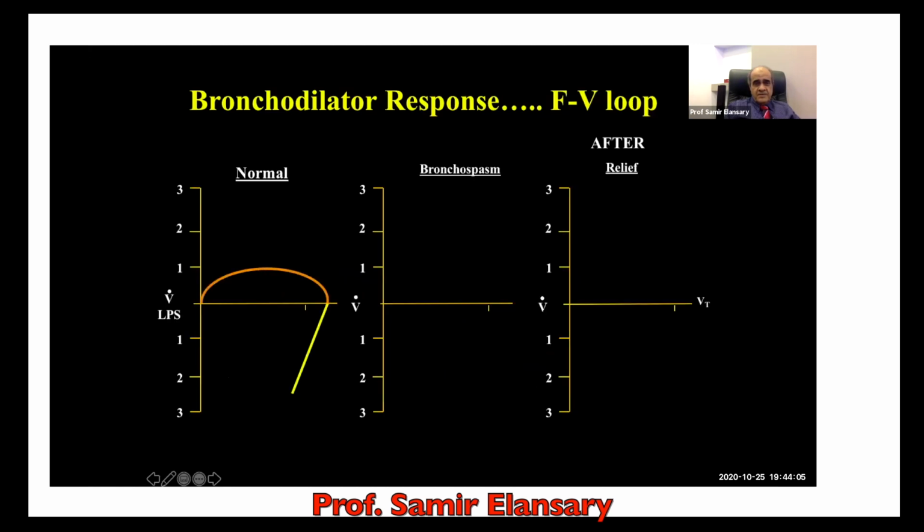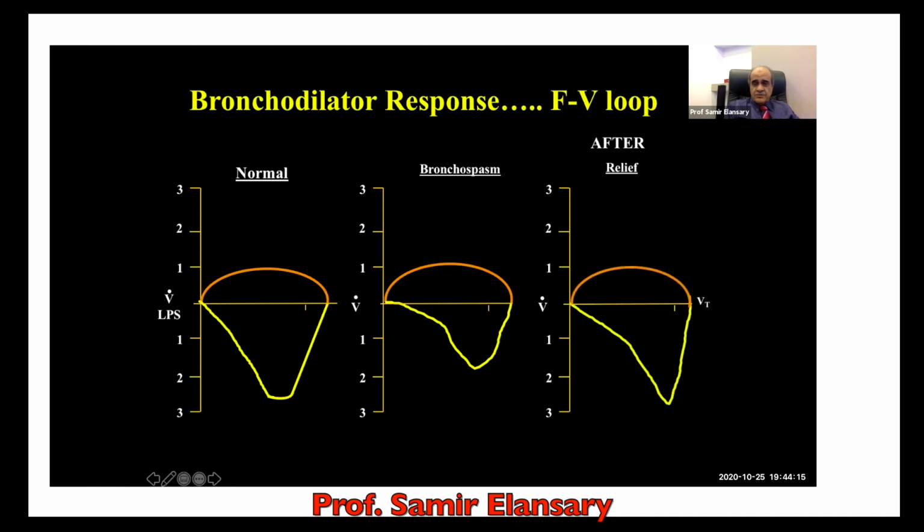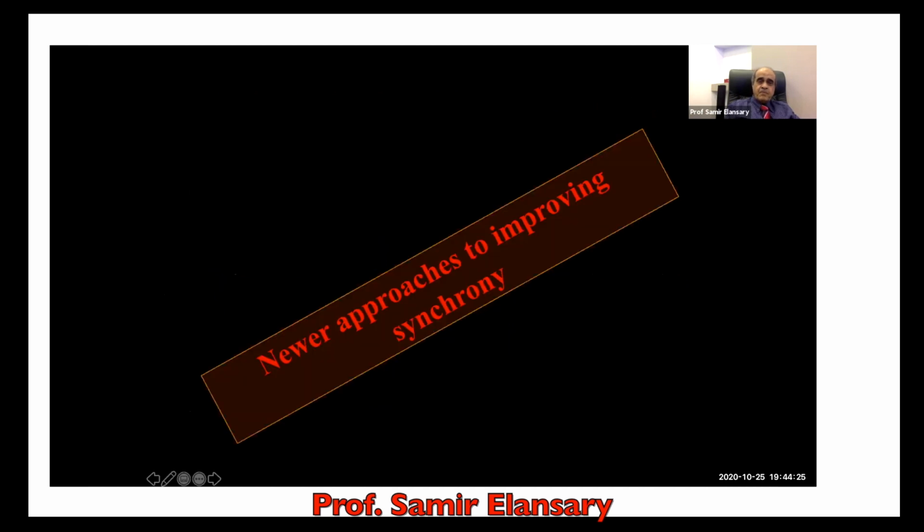Also, in some patient exhibiting spasm after bronchodilator administrations, you can demonstrate the effect of your bronchodilators. You will see here the peak expiratory flow will be increased, and even the expiratory curve will be straight, not cusping or scalloped like this.